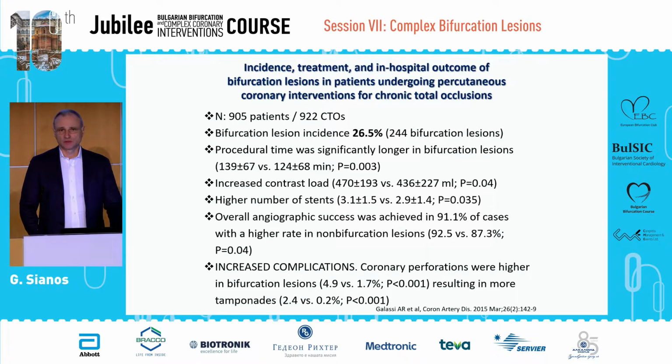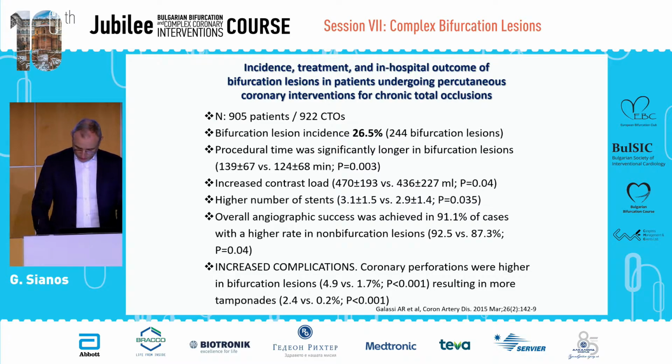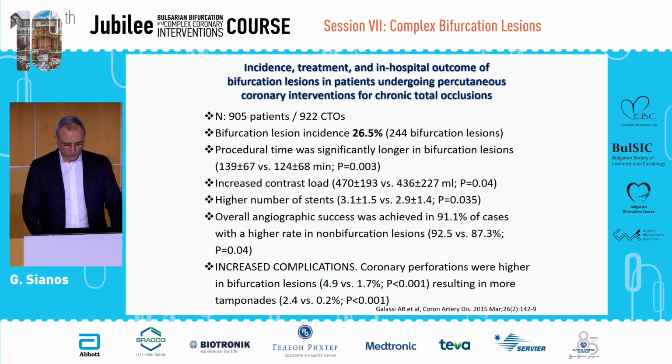Sometimes CTOs involve the side branch as a treatment or the main branch as a treatment, but the branch is not occluded, or the target is just one vessel occluded, or there are true bifurcations beyond the cap, or bifurcation CTOs. So the procedures can have many variations. But around 1 of 3 patients with CTOs might involve a bifurcation in this treatment.